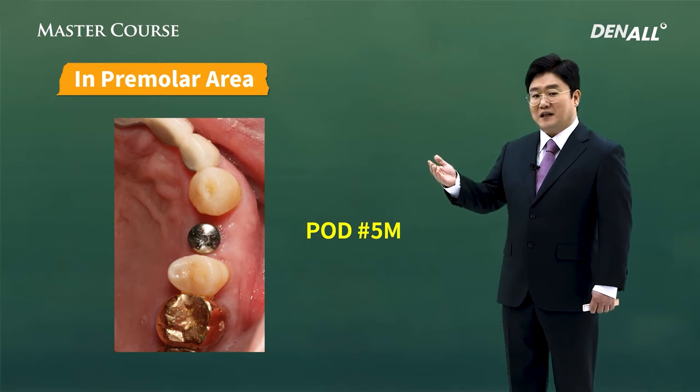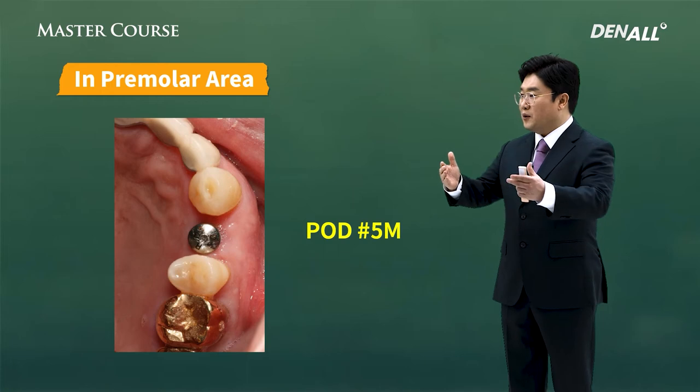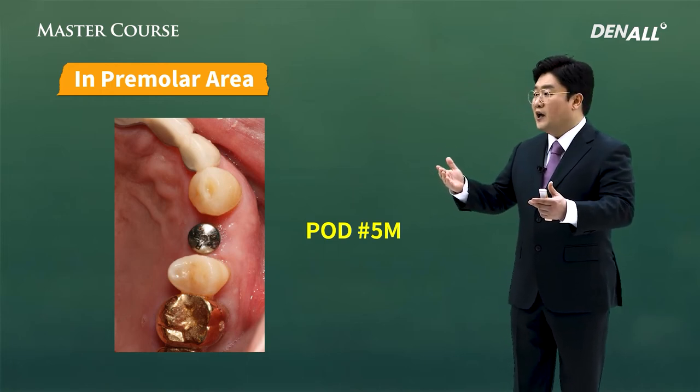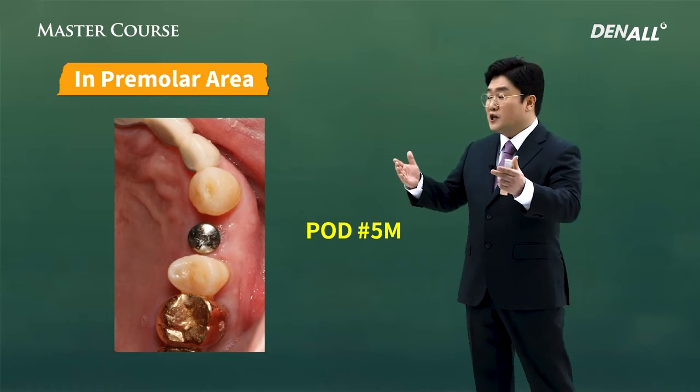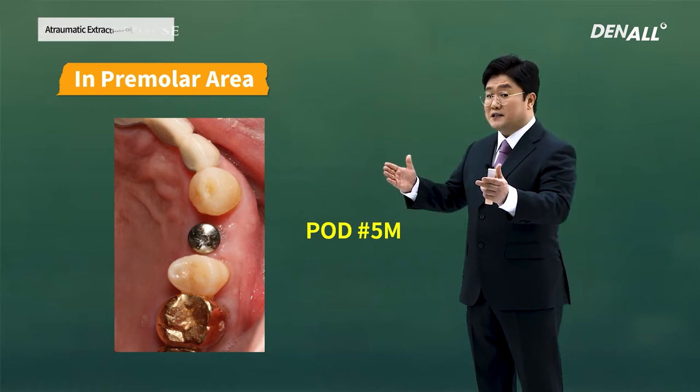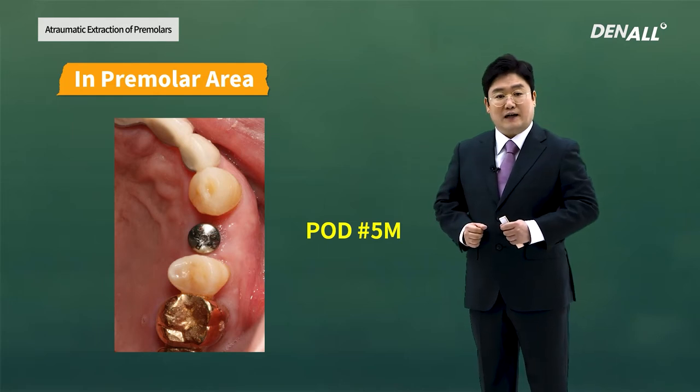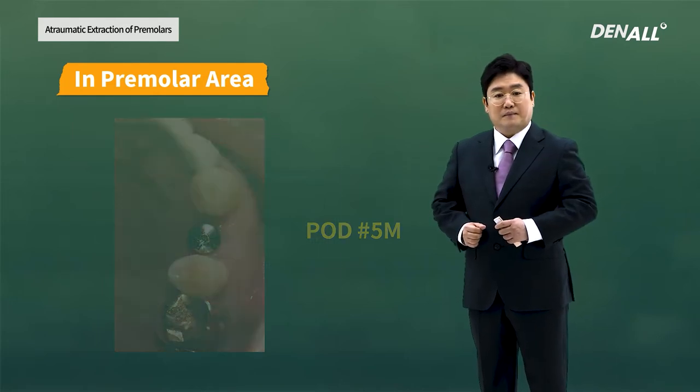5 months after surgery. As you can see, around the implant, especially buccolabially, there is sufficient bone and soft tissue, and we can prevent resorption to some level.